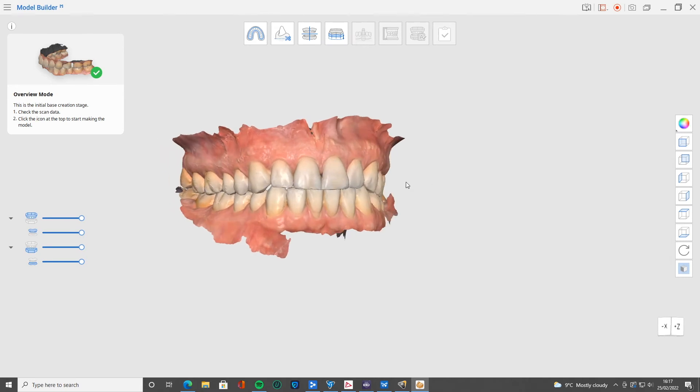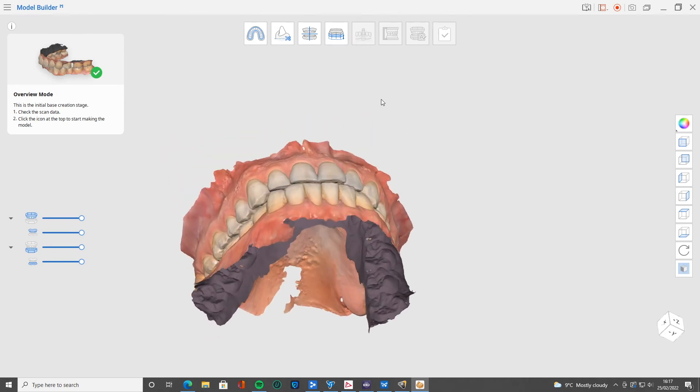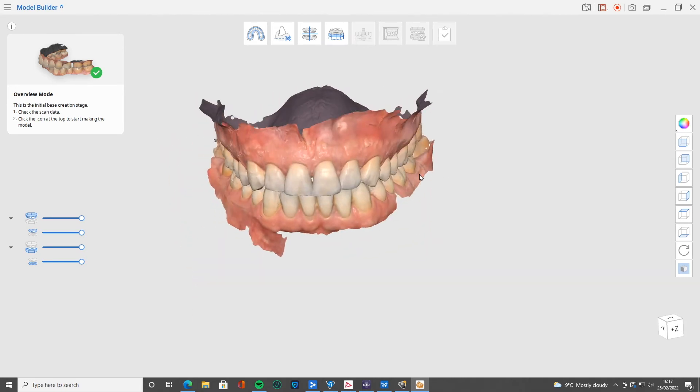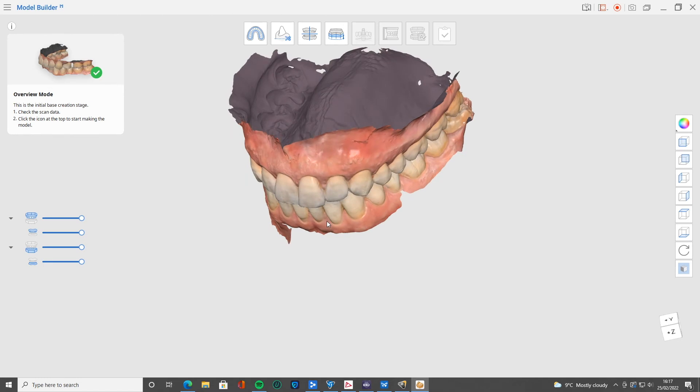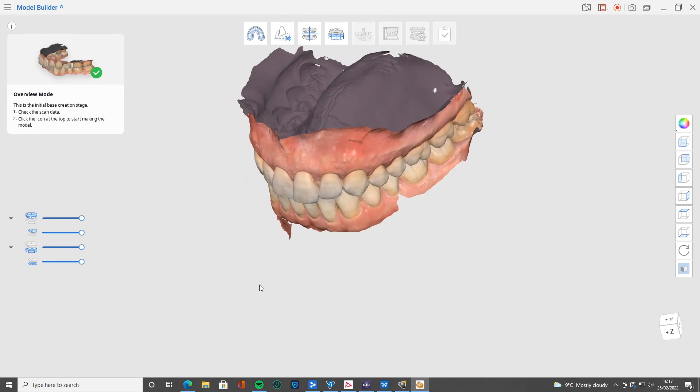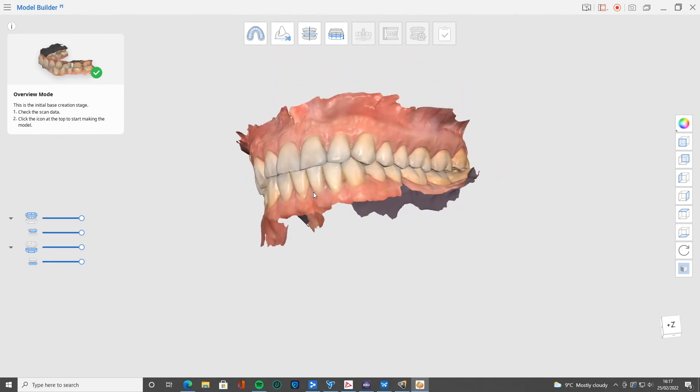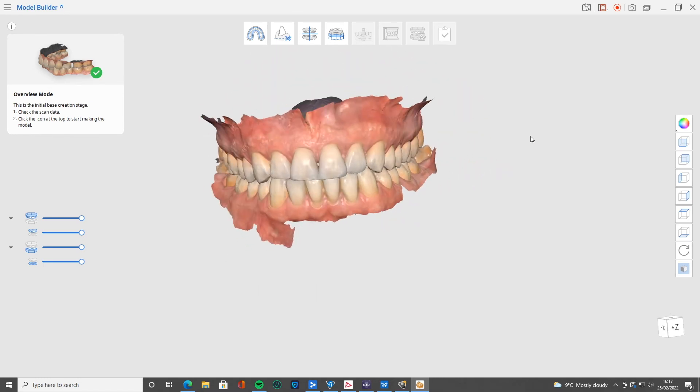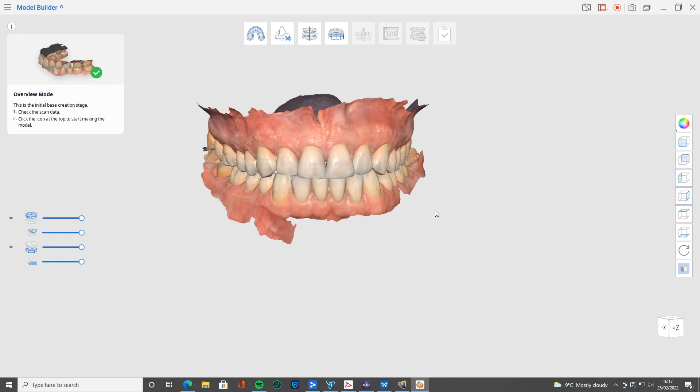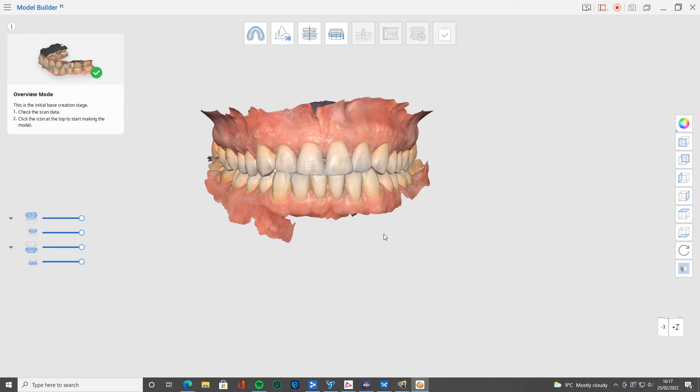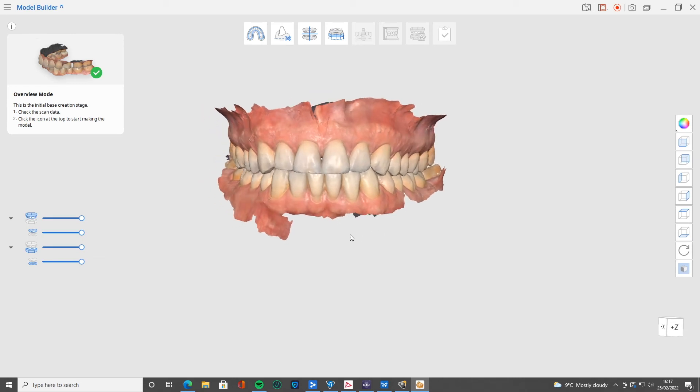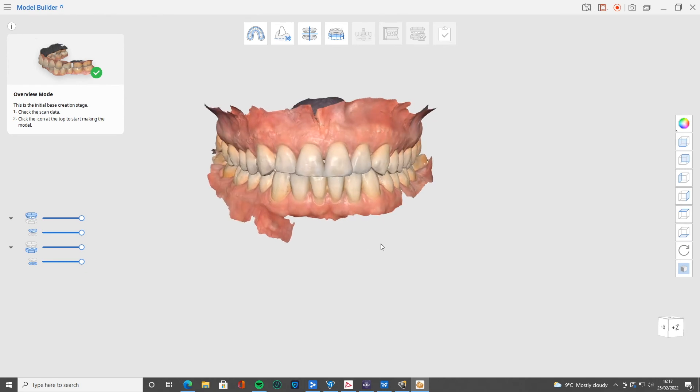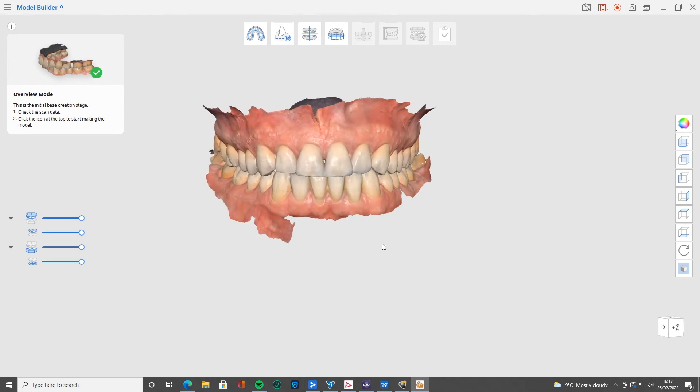The beautiful thing with MeditLink and also with some of the other scanner apps now is that they're all really evolving to include apps that can convert to a model very nicely and easily. But let's talk about Model Builder from Medi today. First step, we can see on the top left here, overview mode. This is just checking the scan data and making sure that everything's good.